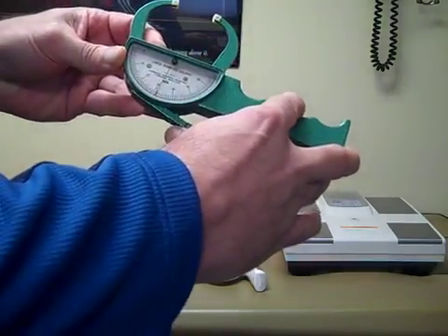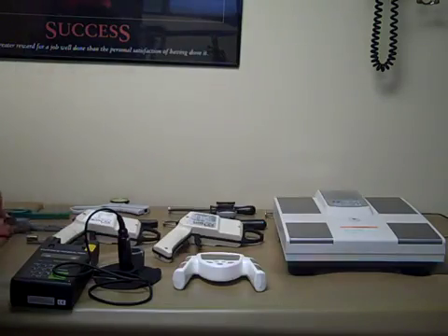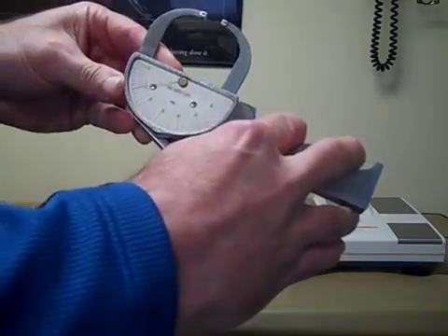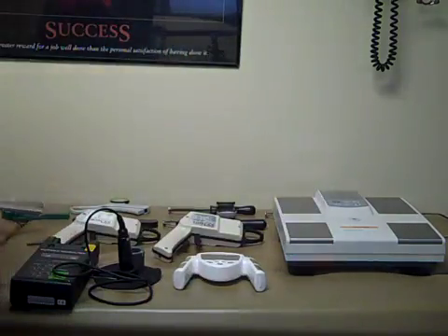You can see the increments are within one millimeter increments. They also make Langs that come in two millimeter increments. Obviously, the resolution is not as good, so sometimes you have to check when buying to make sure you're getting the right type.